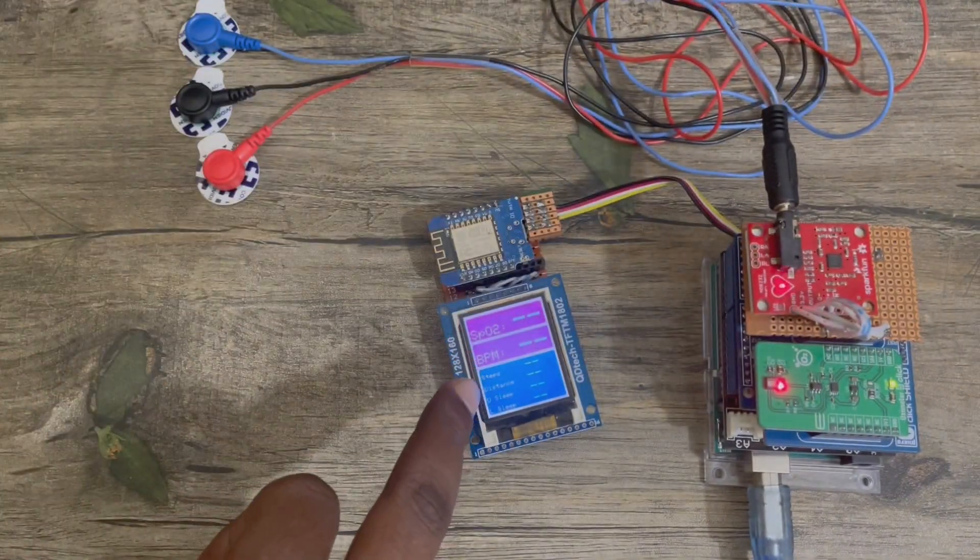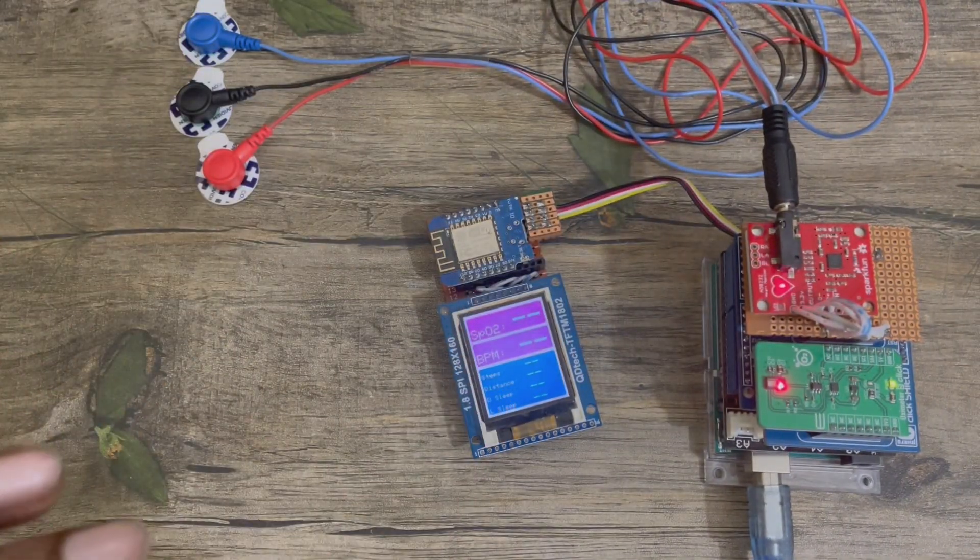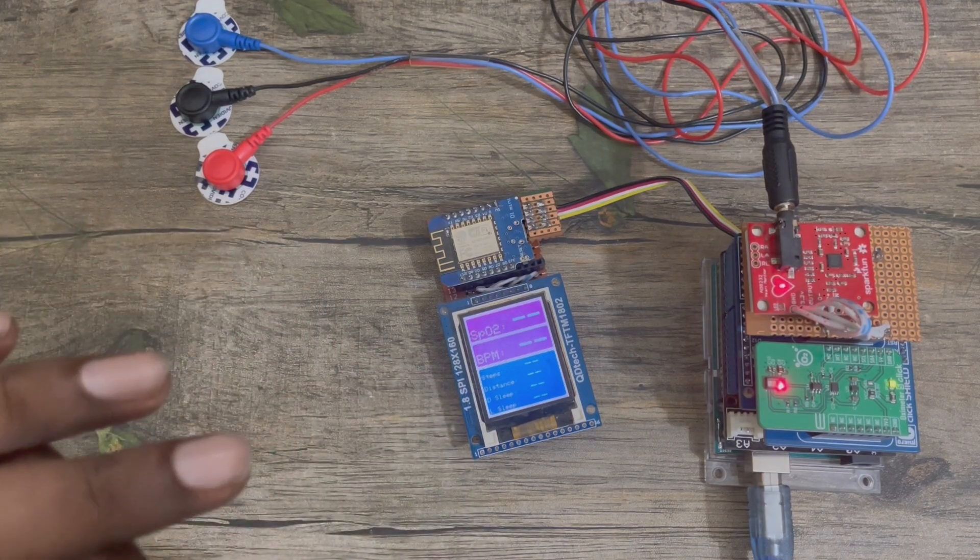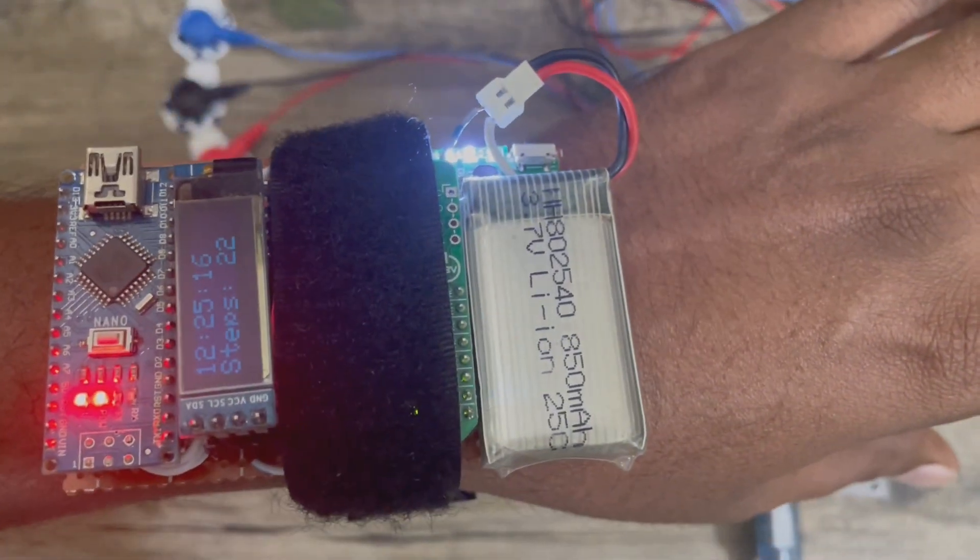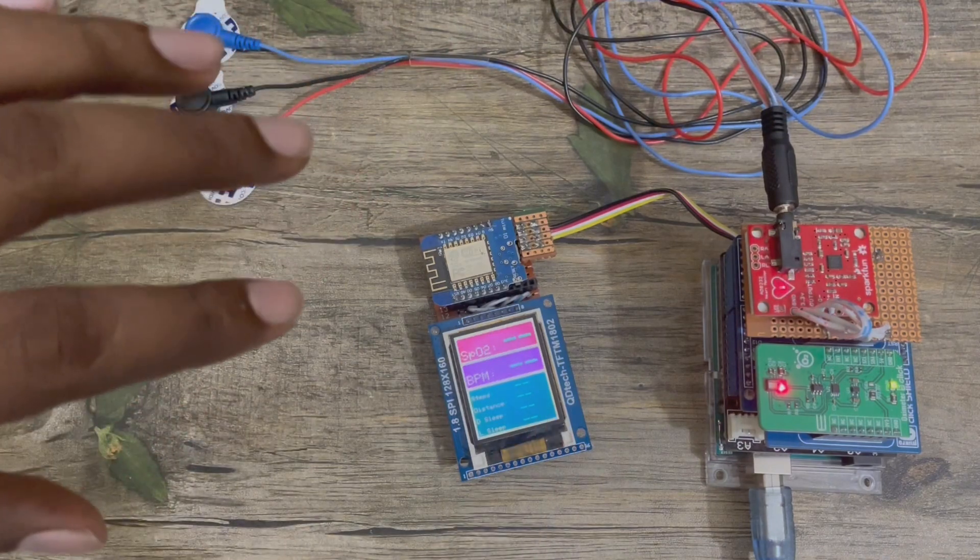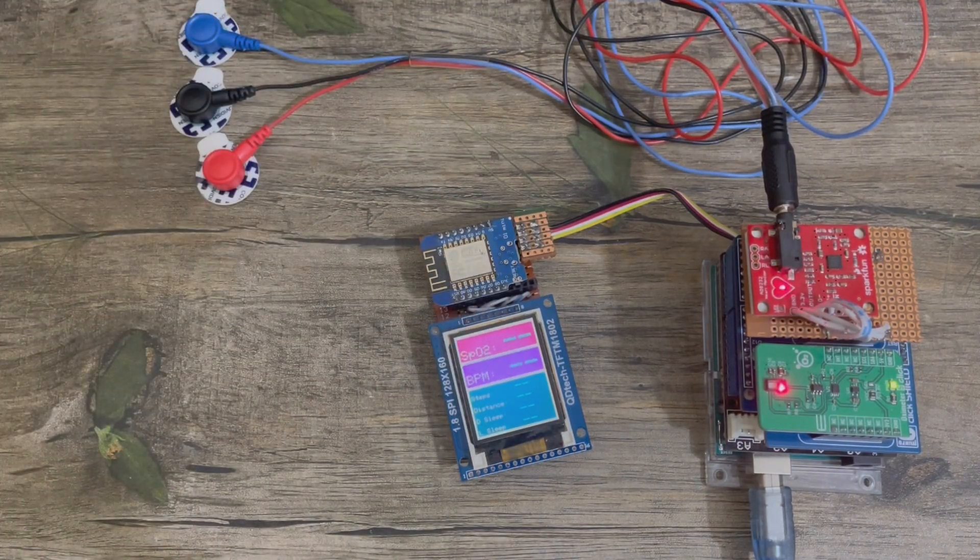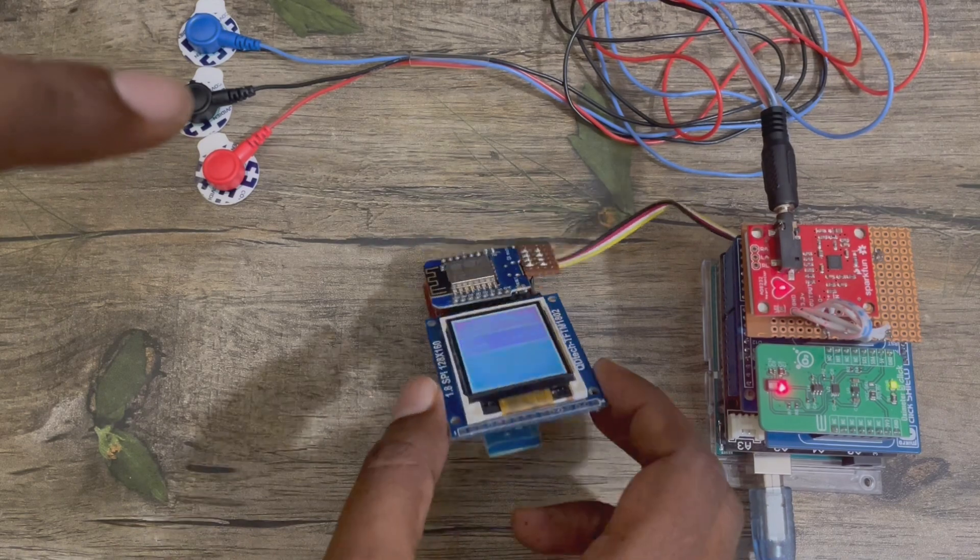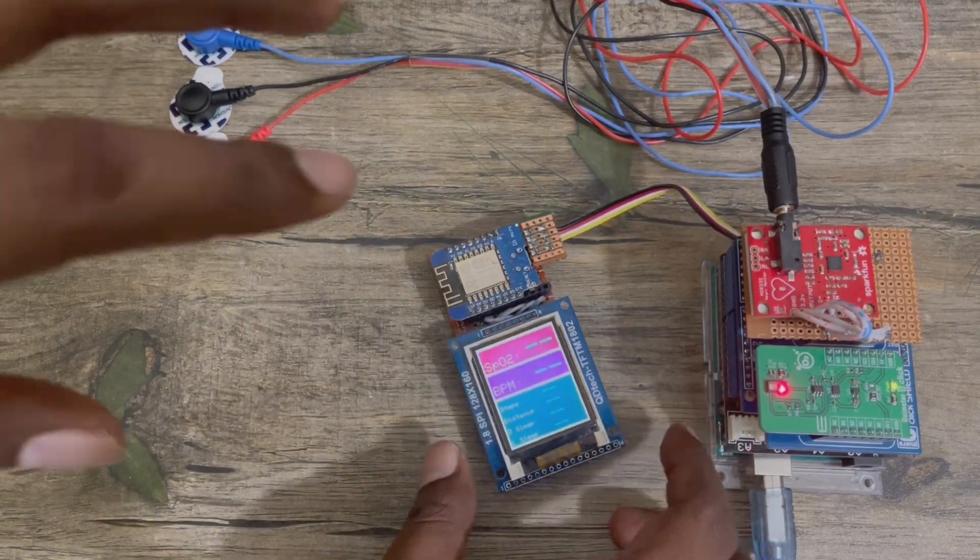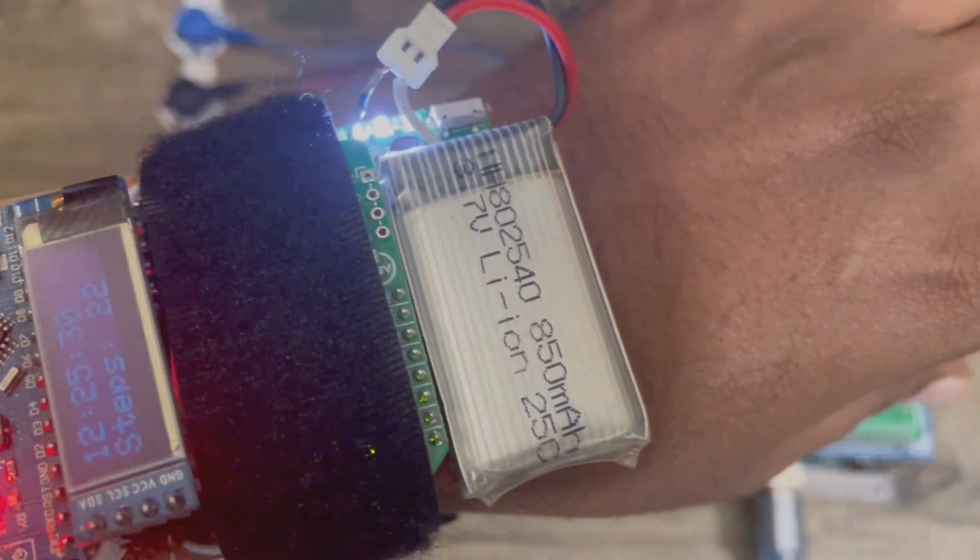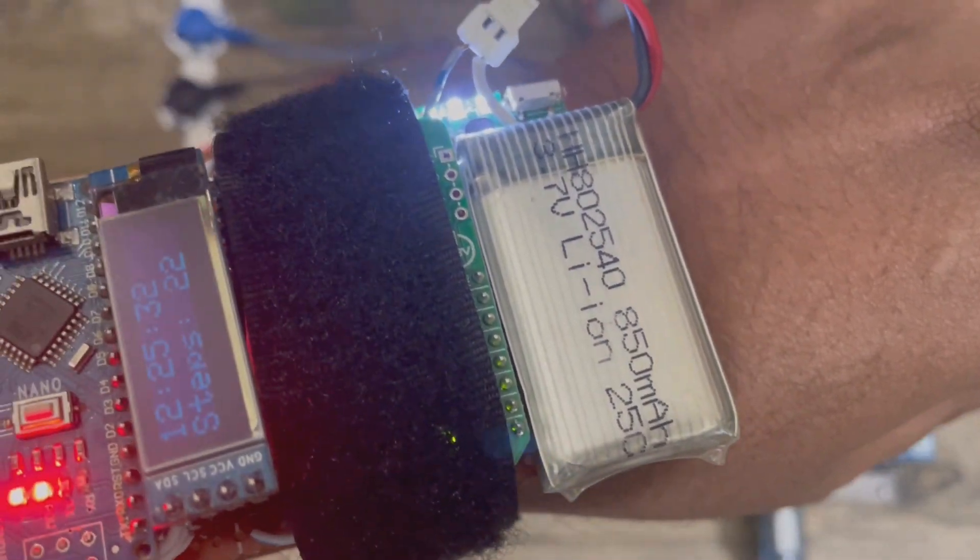This unit display is showing no data, as it doesn't receive any data yet. Wearable unit and this main unit actually communicate through the Bluetooth. There is a Bluetooth here under the display, and this device also has a Bluetooth under the sensor.